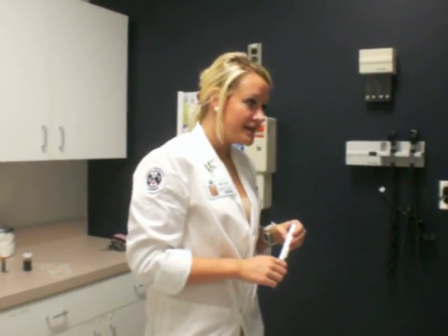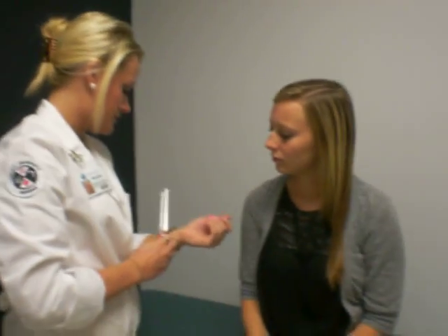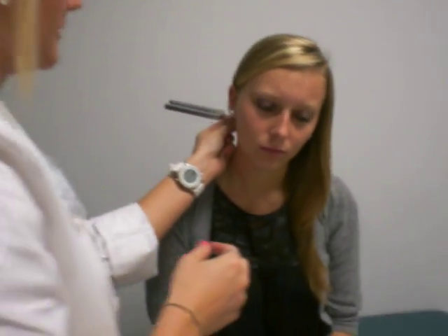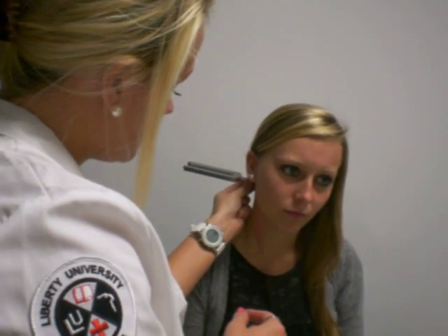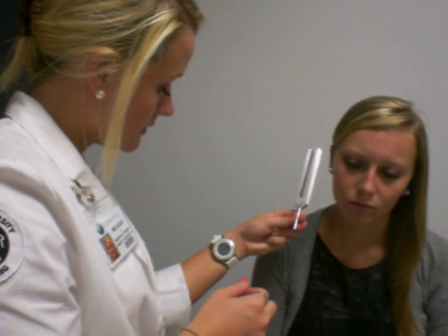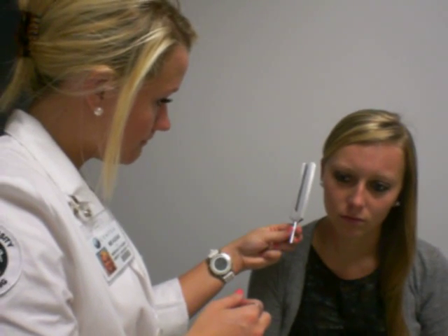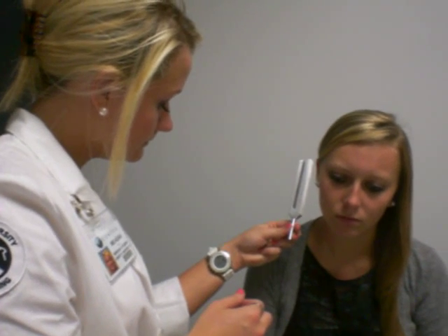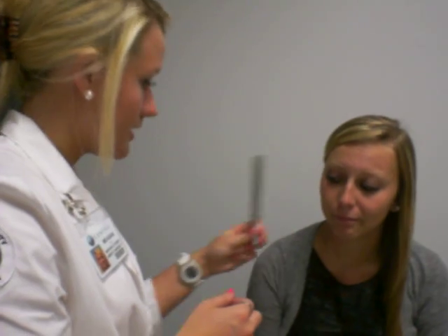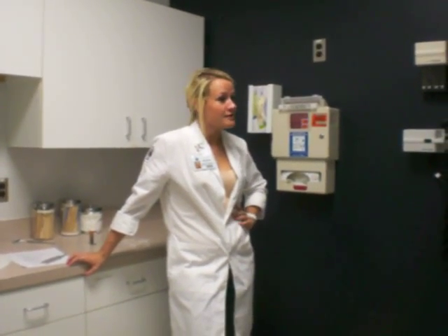Okay, next we're going to do the Rinne test. So if I could have you just push your hair behind your ear again. Alright, you just let me know when you don't hear it anymore, right? Okay. Alright, your bone conduction was about 10 seconds, and your air conduction was about 30, which is great because normally we would want a 2-to-1 ratio, and you're about 3-to-1, which is really good.